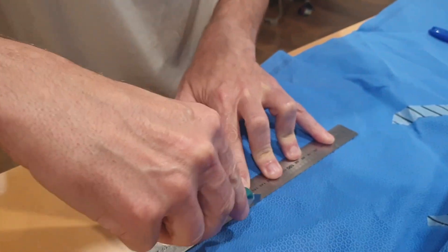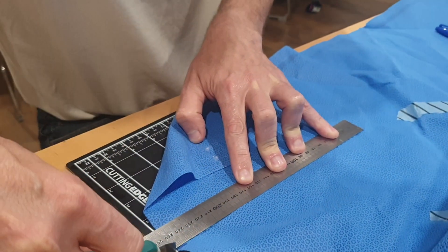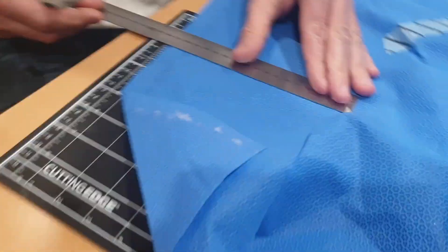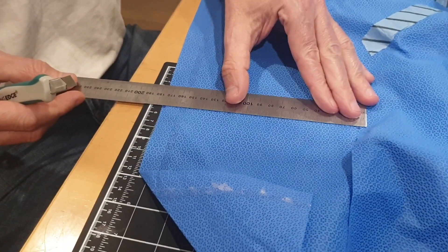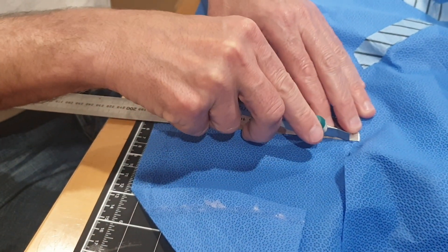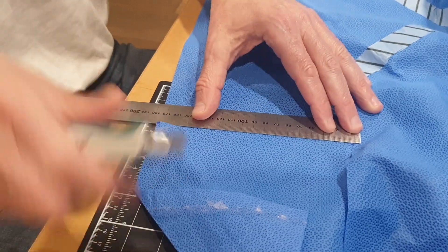Depending on whether you wish to make a one or two layered mask, cut either one or two layers of sterilization wrap material, as used here, into a 17 by 21 cm piece. In this video, we have used Halyard sterilization wrap.